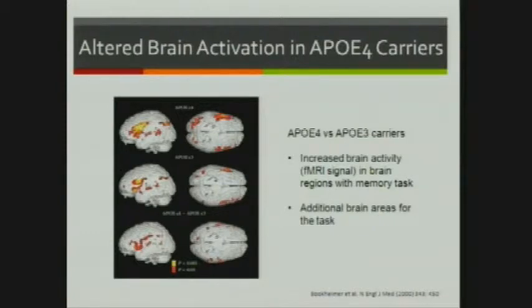So this also gives us a biomarker to tell the risk of hypometabolism in APOE4 carriers. From these studies, people are suggesting whether we should recruit all these people with APOE4 genes and do brain imaging, so they know they have the risk and can pay attention to their lifestyle and what they do in life, so they can reduce or retard the onset of Alzheimer's disease. This is one line of thinking about using imaging to help diagnose early or detect the risk for Alzheimer's disease.